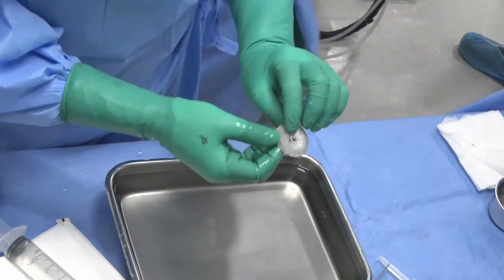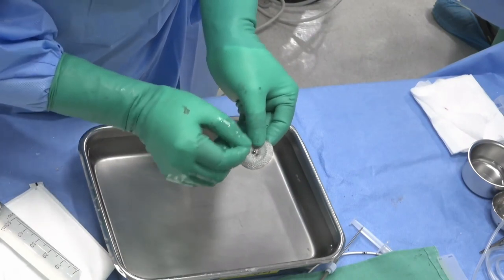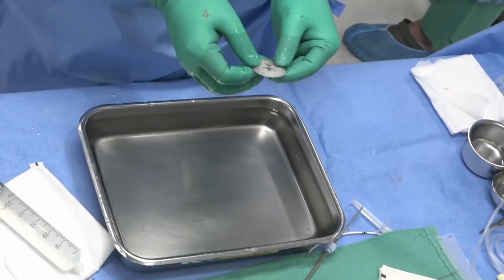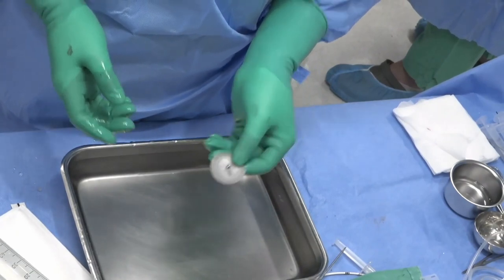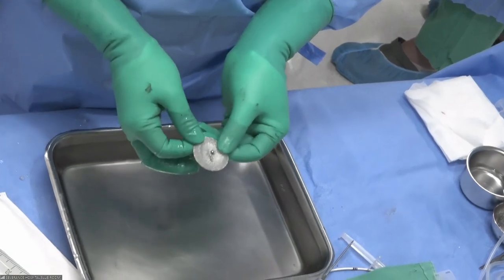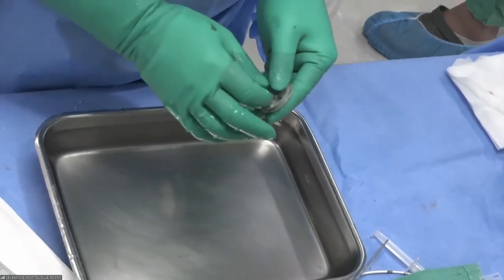So I have already made some fenestration here, but at this time I didn't suture each side of the fenestration because I anticipate the spontaneous closure in the future with some follow-up. Okay, can you see the fenestration here? Yes, clearly. Okay, I'm gonna put this device in and see what happens to the LV end-diastolic pressure, okay?